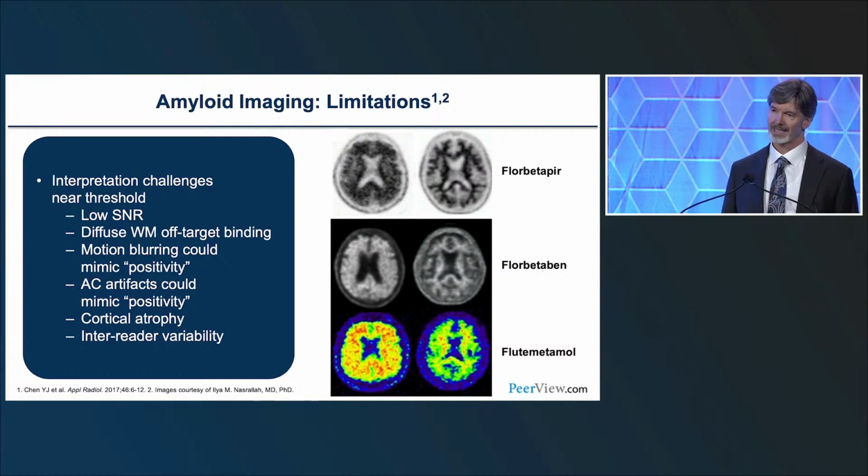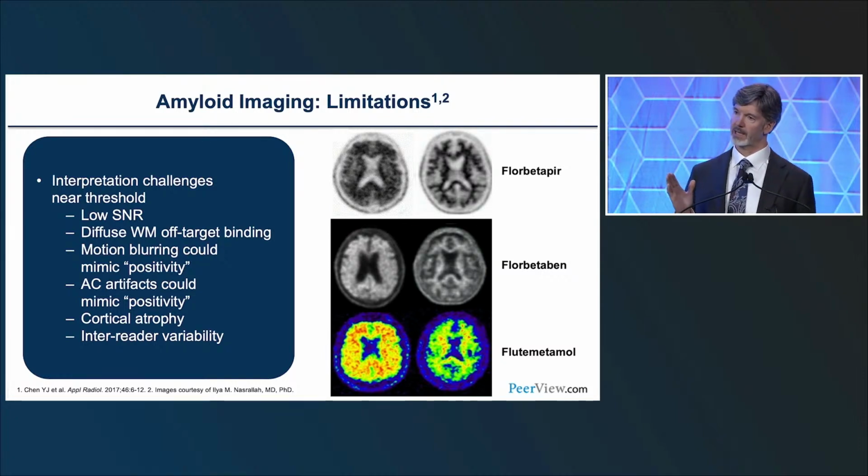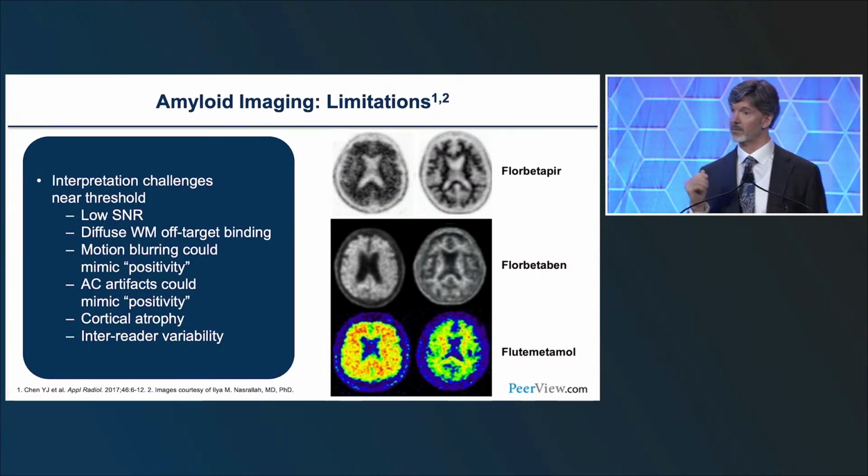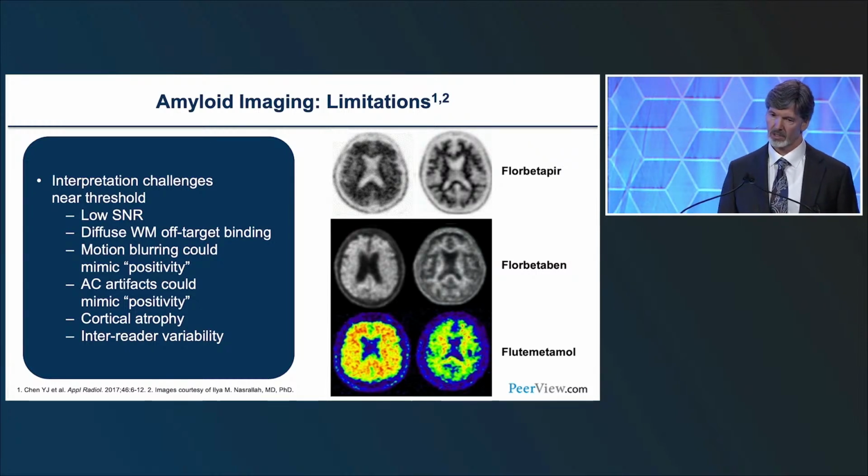Those are sometimes related to attenuation correction artifacts, where the brain on the CT is shifted and it corrects the PET scan incorrectly. Always match your CT scan to your PET scan. Make sure they align. One isn't twisted or shifted. That will change the uptake on your PET scan. You don't want that. You can go back sometimes and reorient the CT, have it redone, and correct that uptake. But you want to make sure you check a few things like that for artifacts.